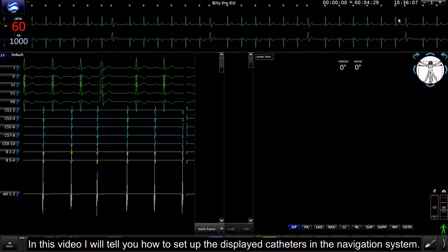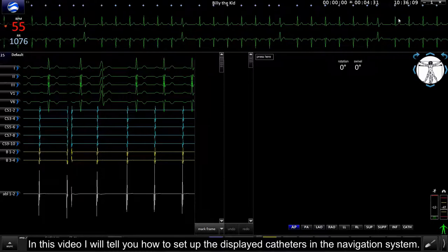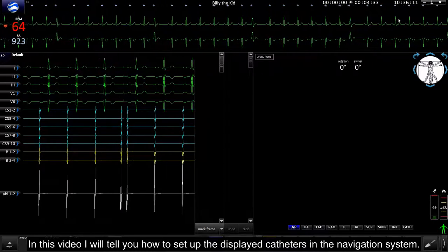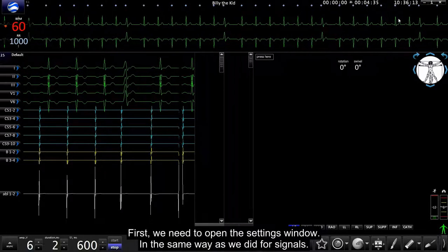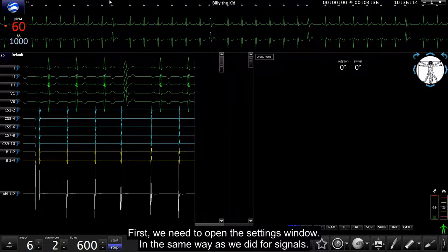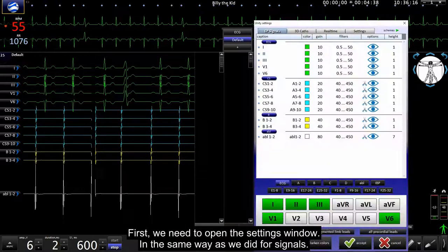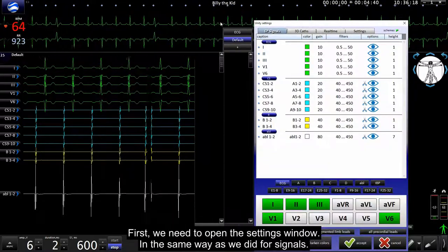Hello, in this video I will tell you how to set up displayed catheters in the navigation system. First we need to open the settings window in the same way as we did for signals.